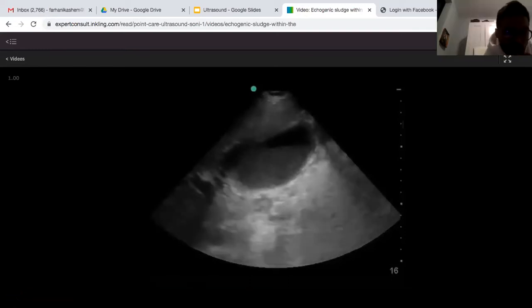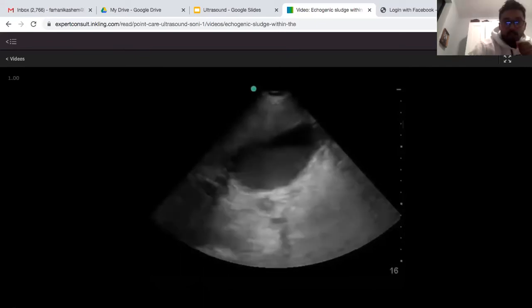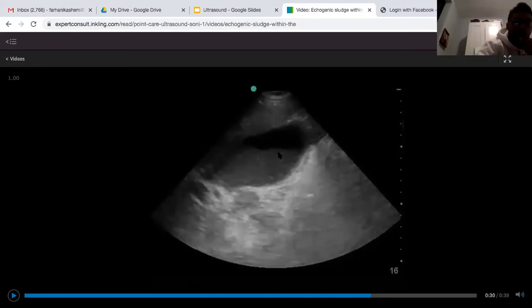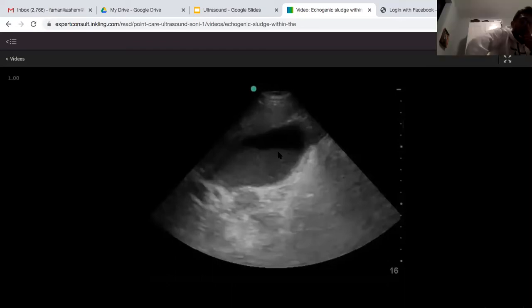Do you see how the fluid within the gallbladder is anechoic, but there are certain regions that are hyperechoic within it, like right here? What do you think that is? Bile, or sludge. It's just concentrated bile. Sludge could also cause impaction or obstruction, but it's just really concentrated bile. It's not normal, but it doesn't cause a posterior acoustic shadow. Do you see a posterior acoustic shadow? Not really, right? But you see something hypoechoic. It's supposed to be anechoic, so that's sludge.